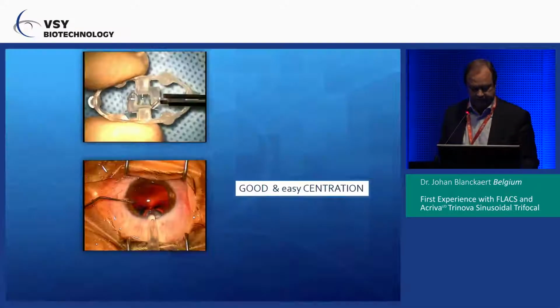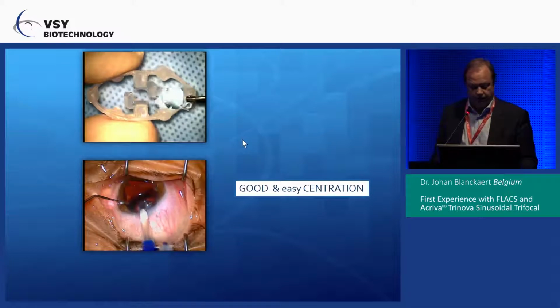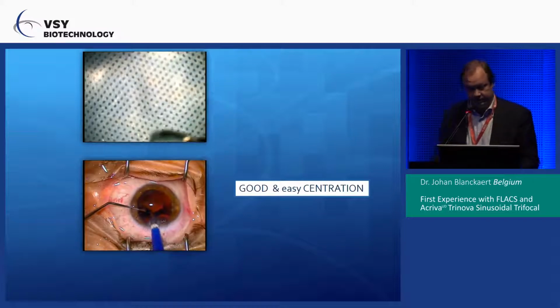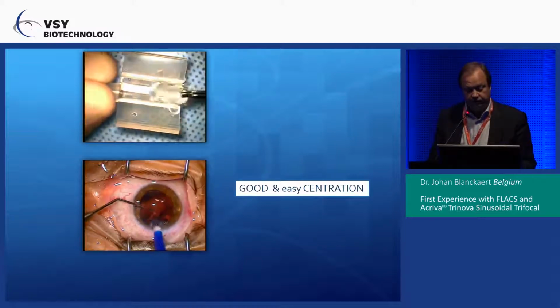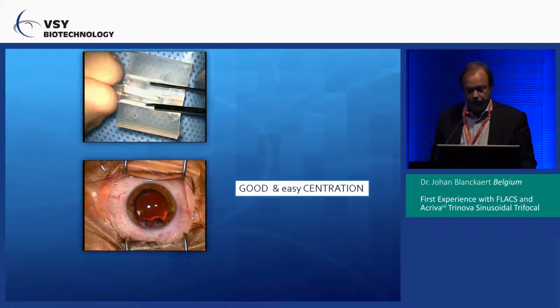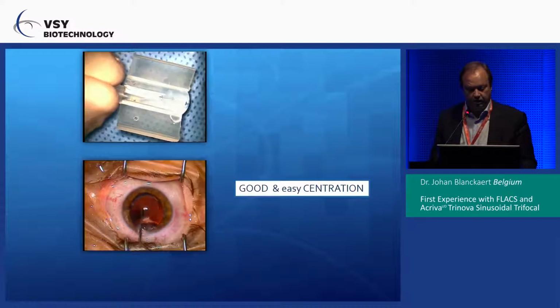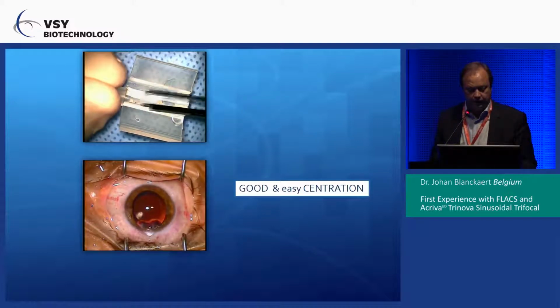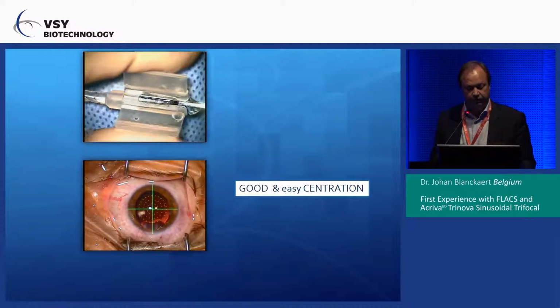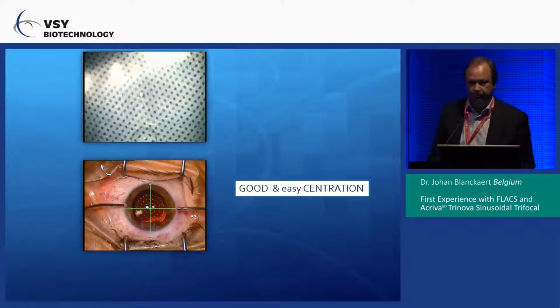on the visual axis. The preparation of the IOL is easy to get it out of your container. Everybody has his own tricks, but to put it into the cartridge, I use a little trick to be sure that it's bent downwards, by grasping the IOL and the cartridge, and now you can close it and hear the click before loading it to the injector.